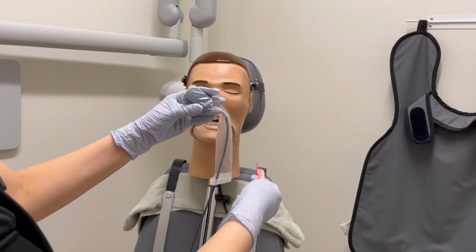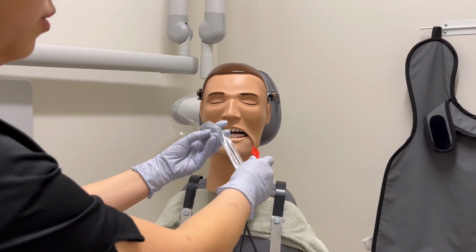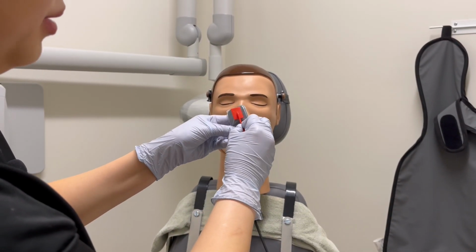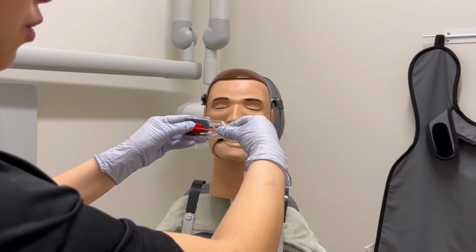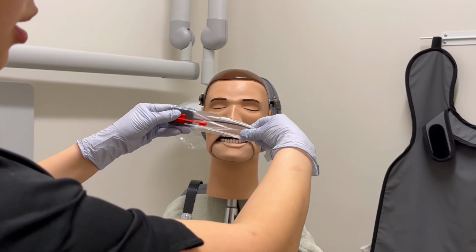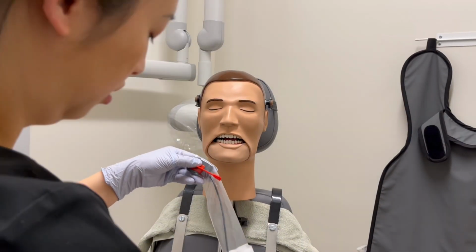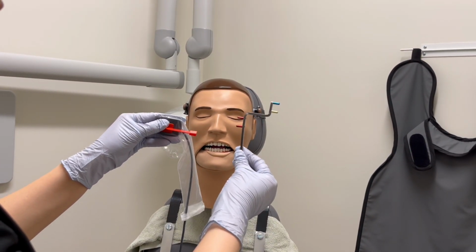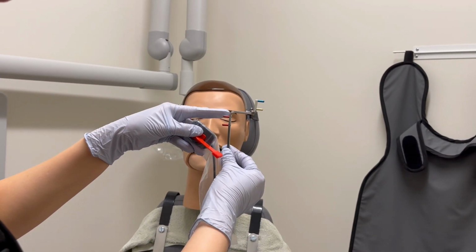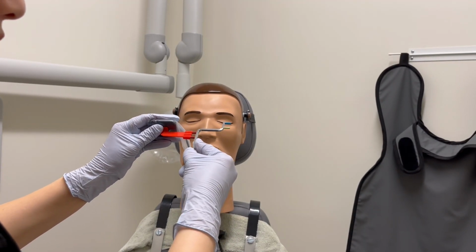Bite wings. Cord is sticking out of your patient's mouth. The red bite block goes on in the center in a horizontal direction. It also aligns with the cord. The indicator arm, the red prongs then go into the bite block.